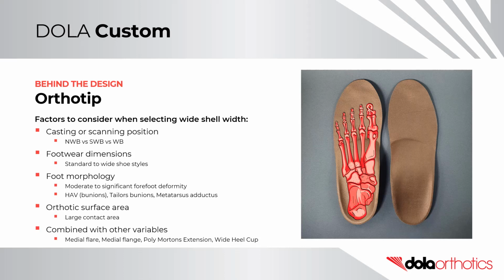Other variables. A wide shell width is often combined with other prescription variables, including medial flare, medial flange, Mortons Extension, and a wide heel cup.